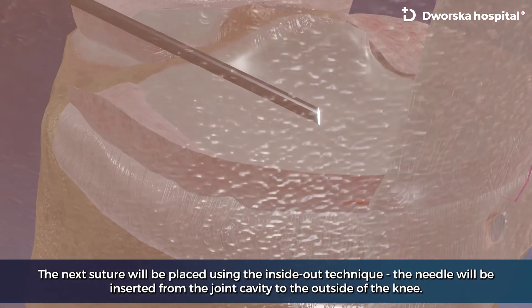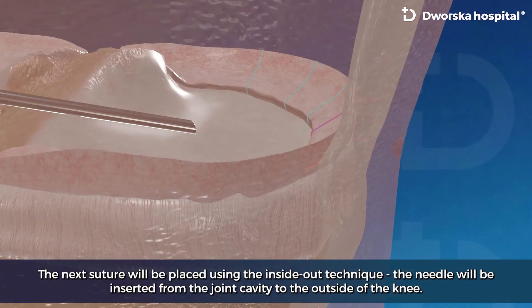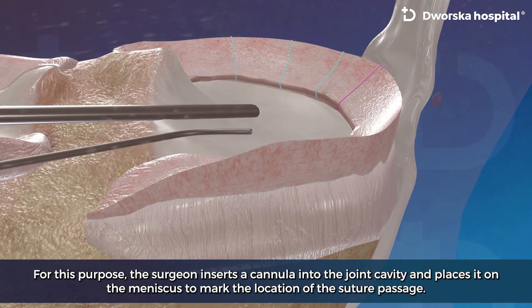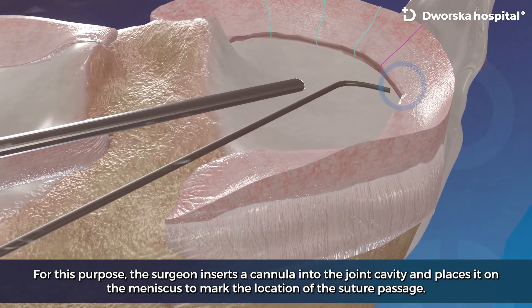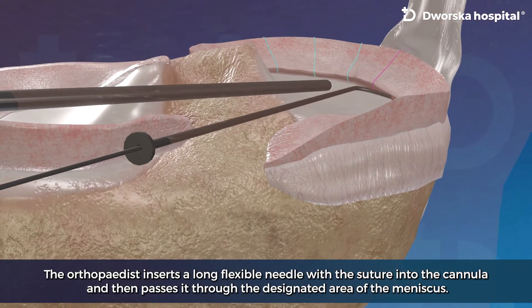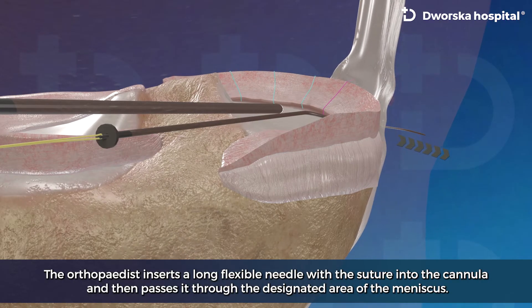The next suture will be placed using the inside-out technique. The needle will be inserted from the joint cavity to the outside of the knee. For this purpose, the surgeon inserts the cannula into the joint cavity and places it on the meniscus to mark the location of the suture passage. The orthopedist inserts a long flexible needle with the suture into the cannula and then passes it through the designated area of the meniscus.